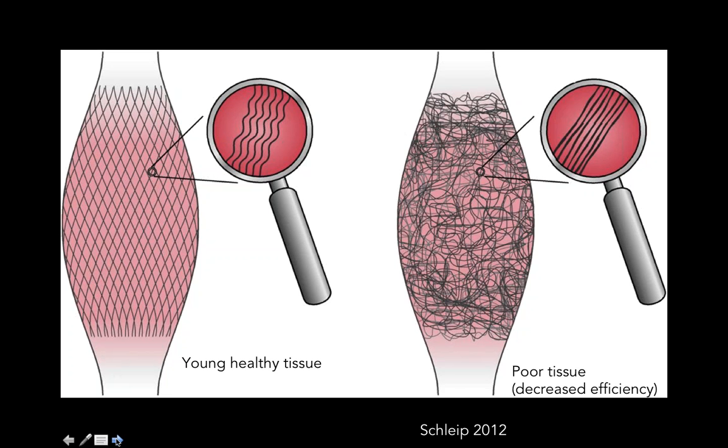It may just be the lack of the slide and the glide of the tissue. So understanding how to assess that within this course, understanding how to treat that, and then understanding how to reassess is a good tool to have to understand this idea of glide and slide. So here we have young, healthy tissue, this kind of lattice-looking, matrix-looking effect that glides and slides throughout the body as somebody goes through plantar flexion and dorsiflexion.